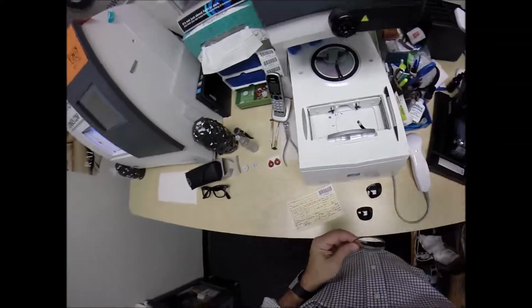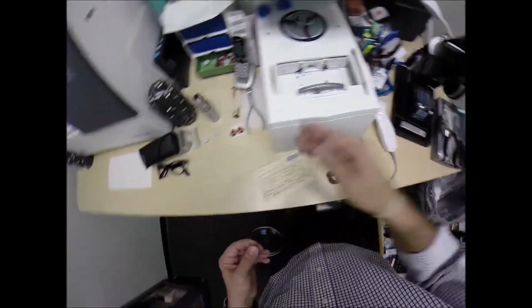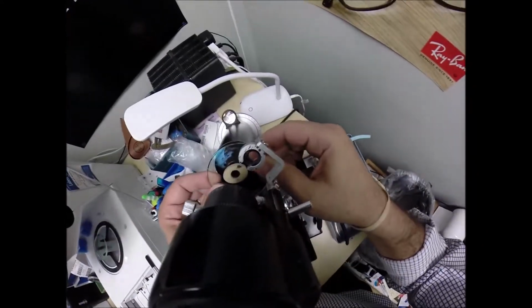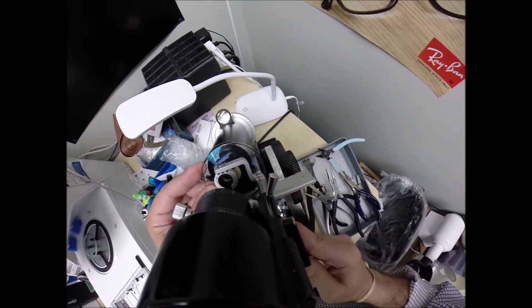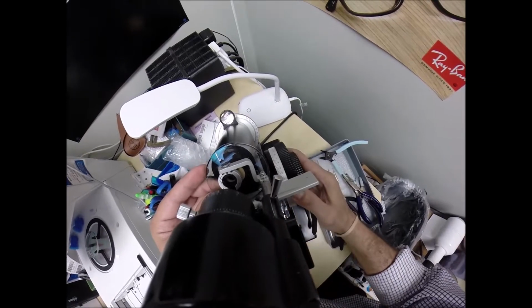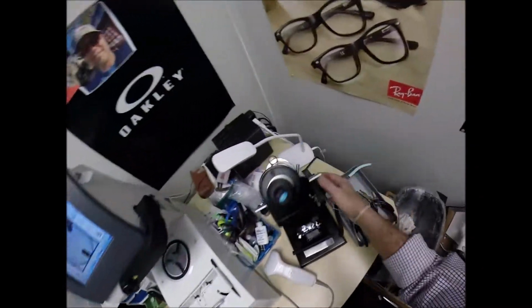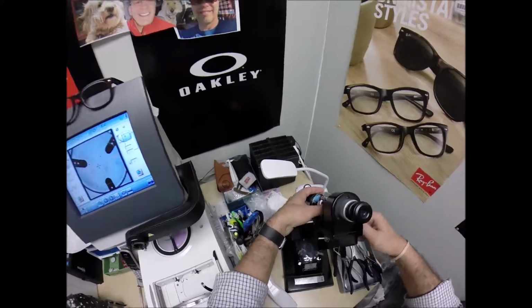Okay, let's do the same thing for the left. Turn the axis wheel to 170. Ooh, I see something cool about that I'm going to talk to y'all about later. Minus 1.75, minus 2 at 170. Turn the power drum to minus 1.75. Put it in, find the spherical component of your prescription, which is the 1.75. Check your astigmatism correction. Let's see, what is the total power? Let's see that. 3.75, yeah, minus 1.75 minus 2 is 3.75. Get everything lined up the way it's supposed to be. Again, put 3 dots on your lenses.